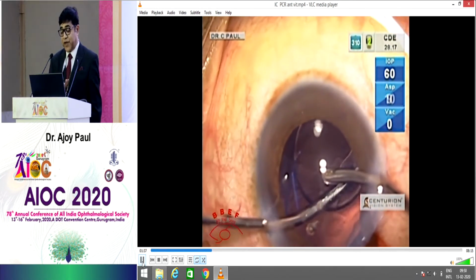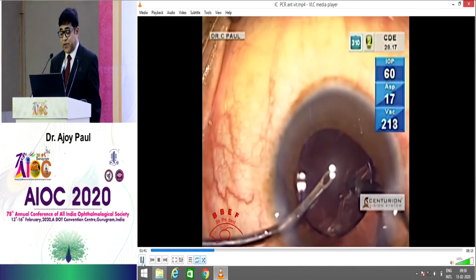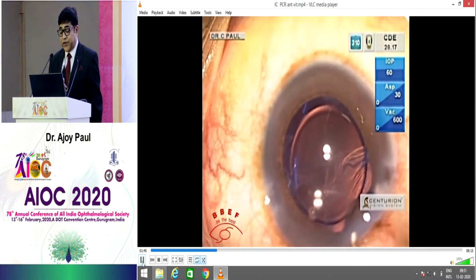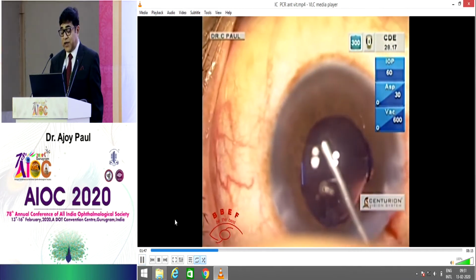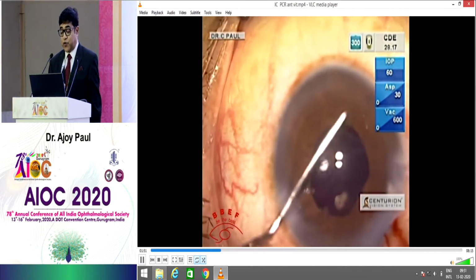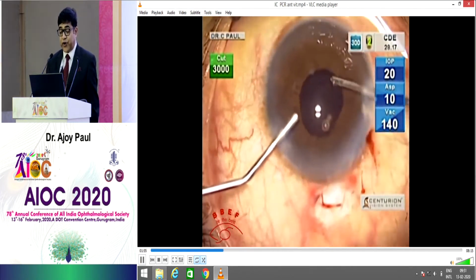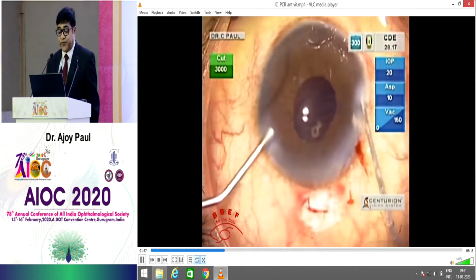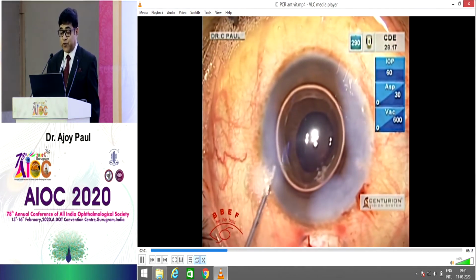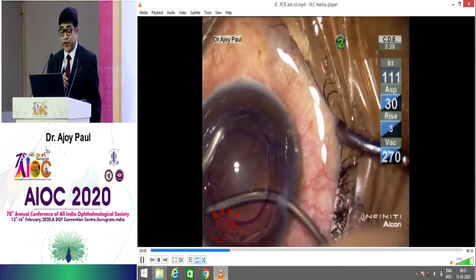I have realized that I have not got vitreous, but by the end of the surgery, as I'm trying to clean the cortex, I might have caught some vitreous strands as I continue that cleaning. Then I clip the lens to the anterior capsular margin, and there I've got a round pupil. I do a bit of anterior vitrectomy, and then the surest test: I just put a blob of air there to see that the air is well formed. That is one of the good tests you can do instead of putting triamcinolone.